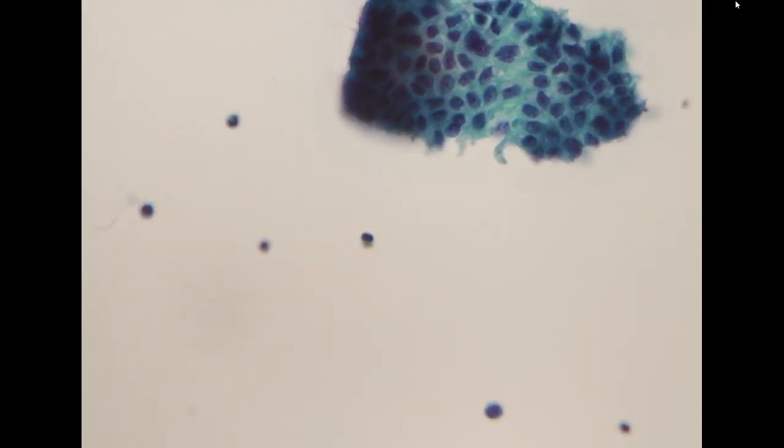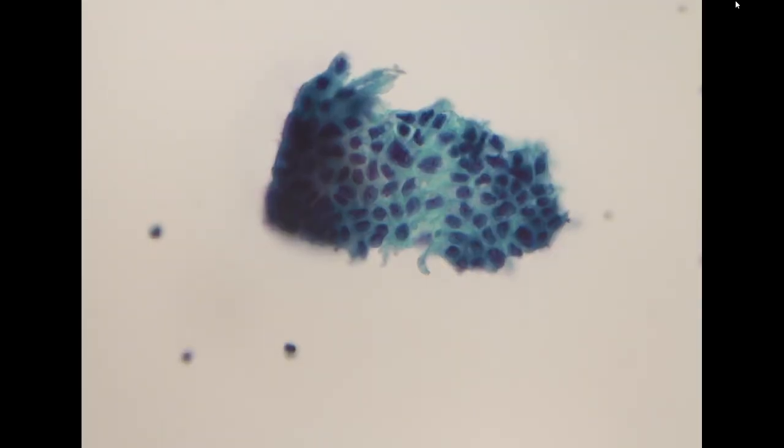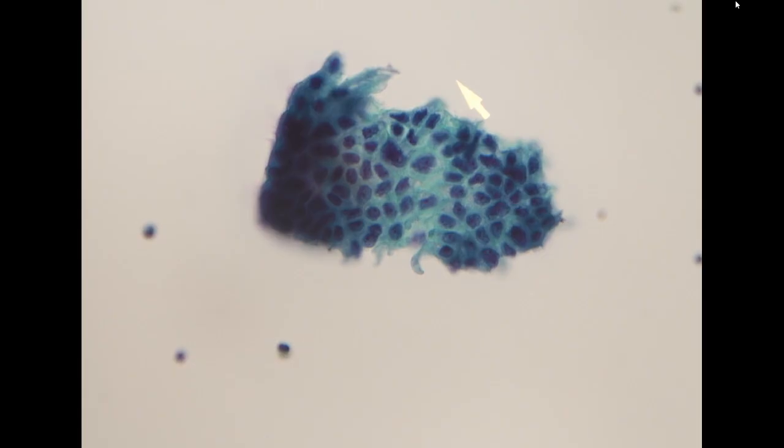I referred the case to Dr. Gao because he got the biopsy. I want to call this adenocarcinoma, but it is very well differentiated, so I just needed to confirm whether he had the same finding in the biopsy, and he does. So we will call the specimen adenocarcinoma.